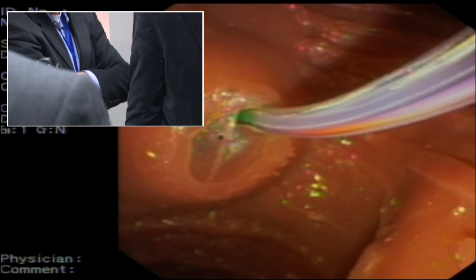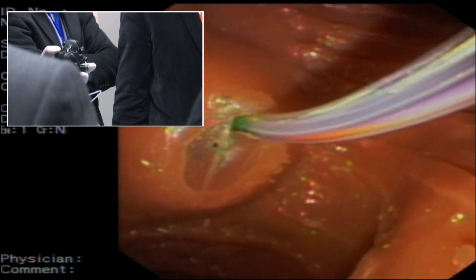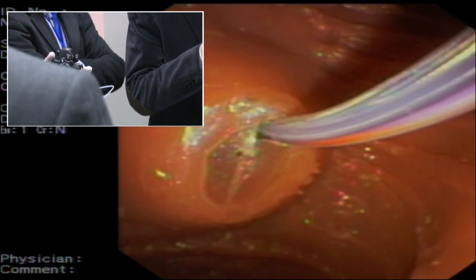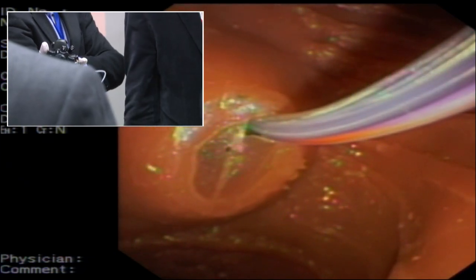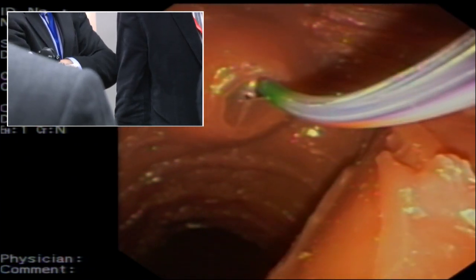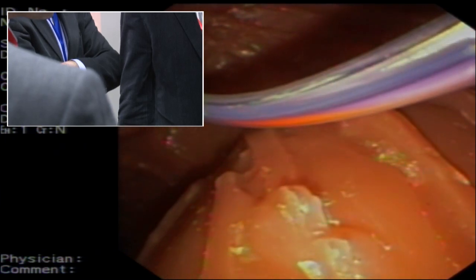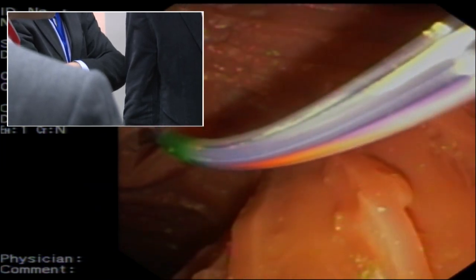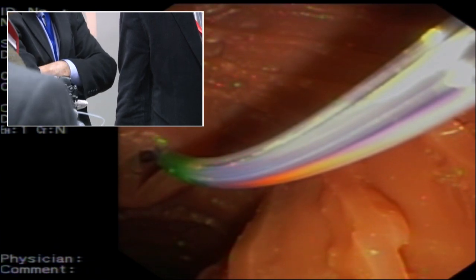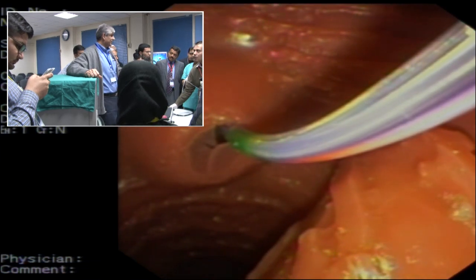Sir, I have 2 options. First, I have to up the big wheel so that I can pull out. You've done that. Okay, good. So now push the big wheel away. Push the ampulla away. Okay, yeah. Now use the other option. Yeah, because it's already a reduced position, so you're not getting that much, and obviously this is also a dummy, but fine, you understand that.